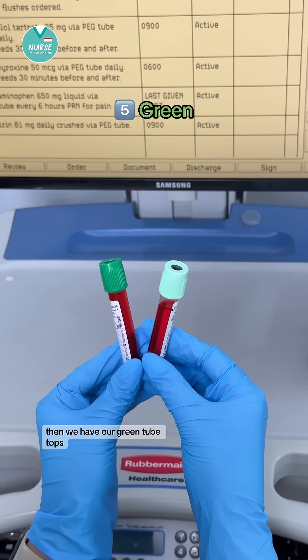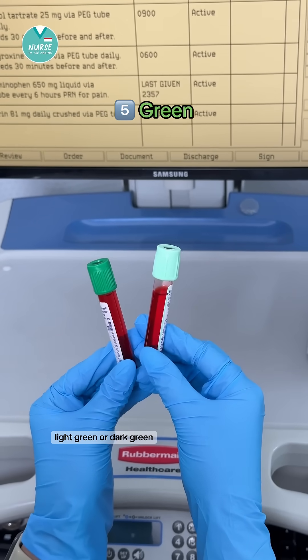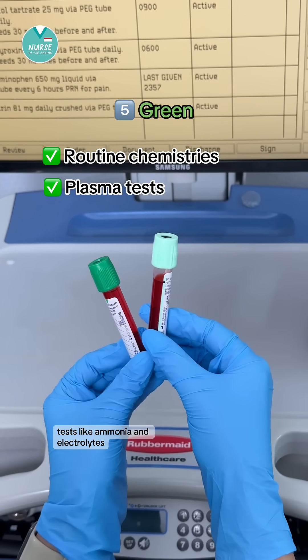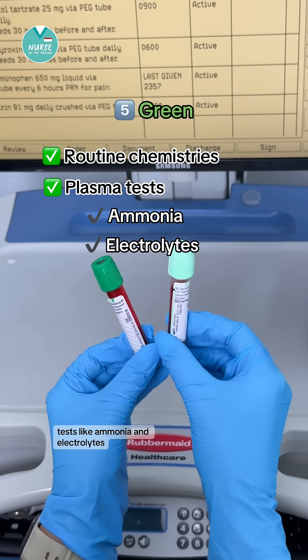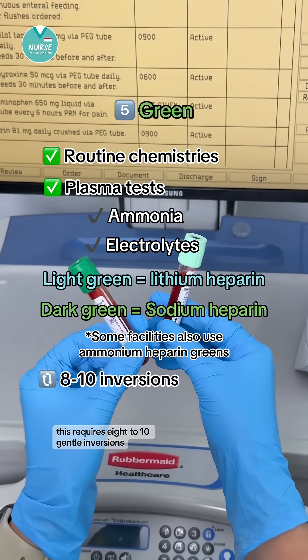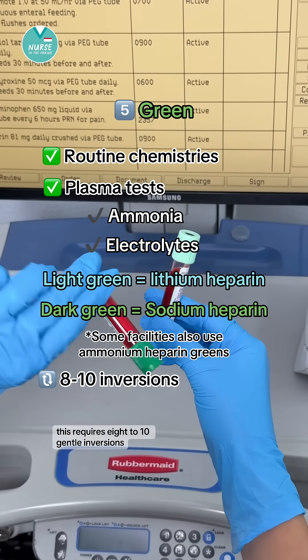Then we have our green tube tops — light green or dark green. These are used for routine chemistries and plasma tests, like ammonia and electrolytes. The light green top is for lithium heparin and the dark green top is for sodium heparin. This requires eight to ten gentle inversions.